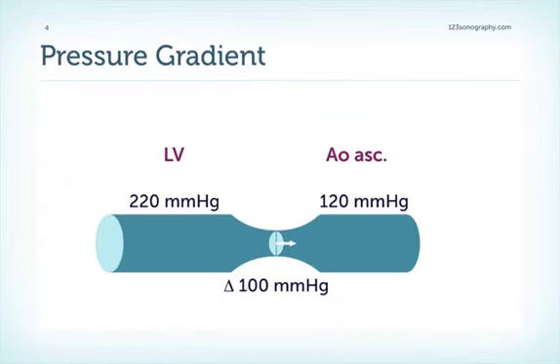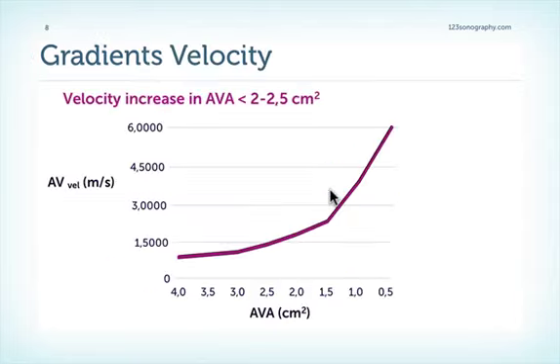So in heart catheterization or with Doppler, we can actually measure the pressure gradient or pressure difference between the left ventricle and the aorta ascendens. Now look at the high pressure the left ventricle has to achieve to get a normal blood pressure in the aorta ascendens if you have severe aortic stenosis. So this is actually the pressure gradient. In Doppler, we are actually measuring the aortic valve velocity, and there is a rapid increase in aortic velocity once the aortic valve area gets below 2 to 2.5 square centimeters, and we can see an exponential increase as the valve gets smaller.